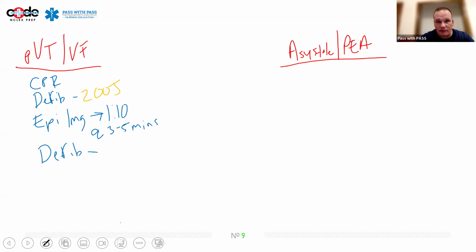We would give our epinephrine after that. Of course, we're doing our 2 minutes of CPR while we give that epi. Our 2 minutes is up. We check a pulse, check a rhythm, still no pulse, still in VFib or pulseless VTAC. We're going to defibrillate again. This time we're going to defibrillate at 300 joules. Now here, you could either do another round of epi or you can go ahead and give your first bolus of amiodarone. And this is going to be a bolus of 300 milligrams.